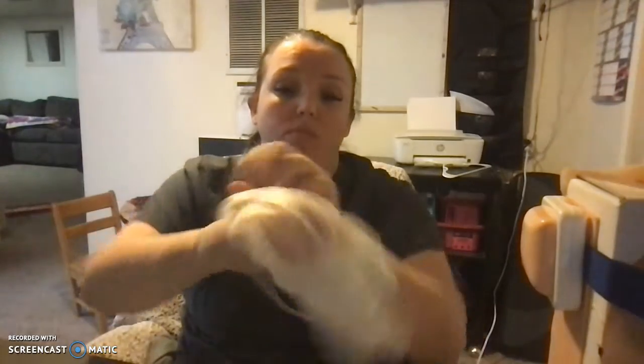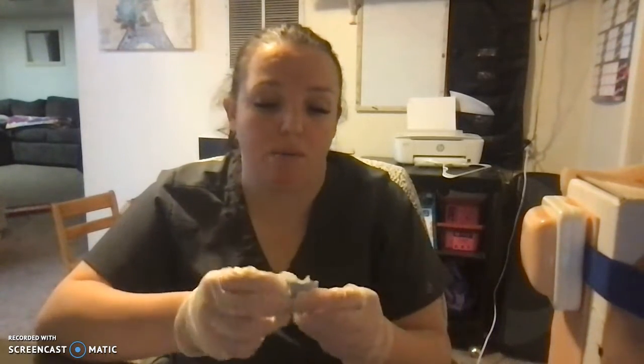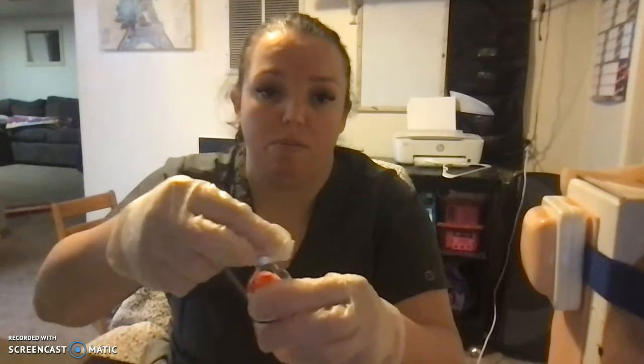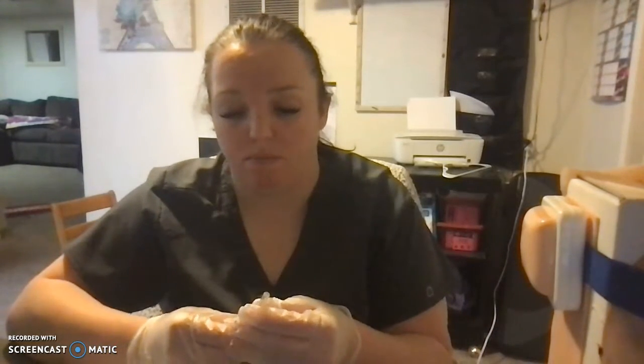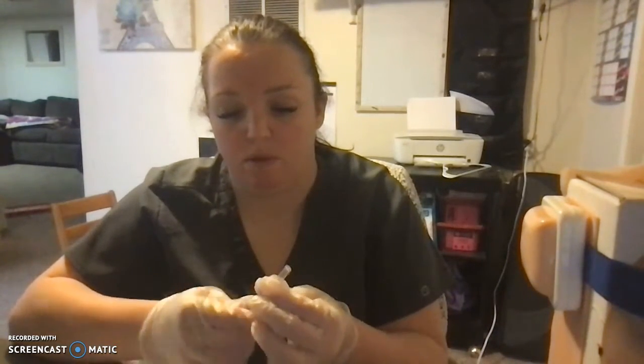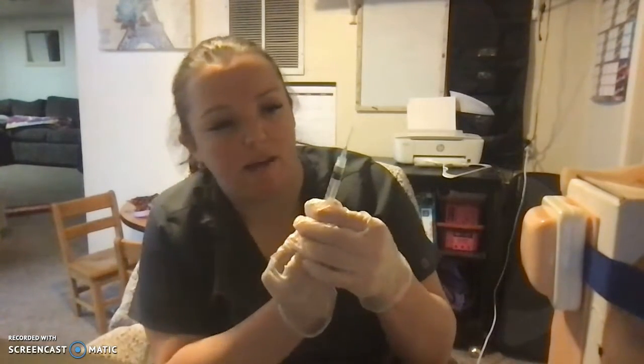At that time, I would perform hand hygiene, put on my gloves, pull my medication. So I would start with an alcohol prep pad, clean the top of my vial, so that way I'm not cross-contaminating anything. I would then pull back to 1.5.